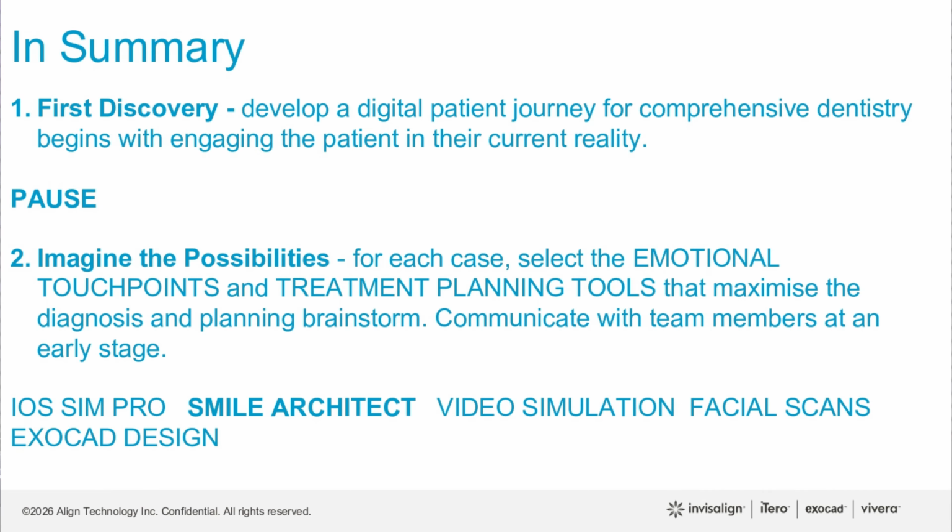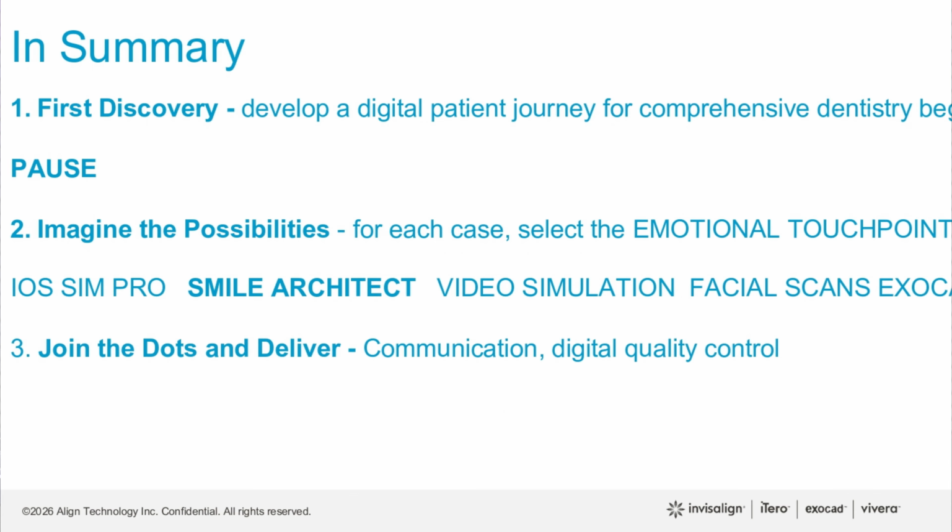So I think that process of gathering the information, first of all, developing a system and practice, though, that we can leverage the technology and we can really utilize the emotional touch points wherever they are for each patient, because not all patients need a live trial smile in their mouth. Lots of patients, we can leverage the digital imaging, which is a much easier way to do it. But we have to be able to flex with the different options that we have.